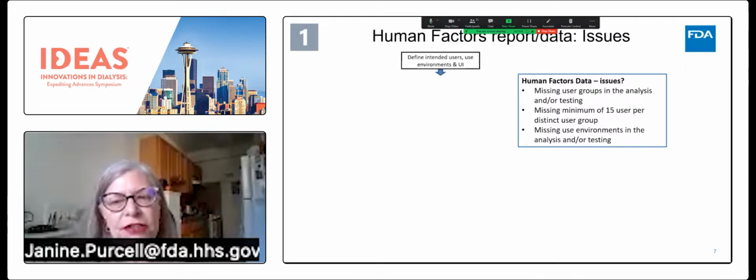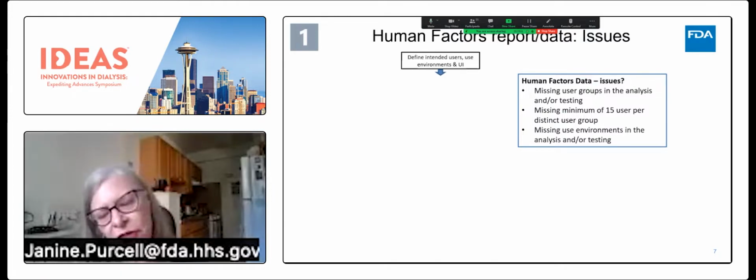Another consideration for that simulation part of the study is whether you're going to be using a mannequin for a patient. And if you're doing that, just having the arm there is not really going to be sufficient. You really need a full-size mannequin because it's going to influence the interaction of people trying to use their equipment around a person that's receiving the treatment.